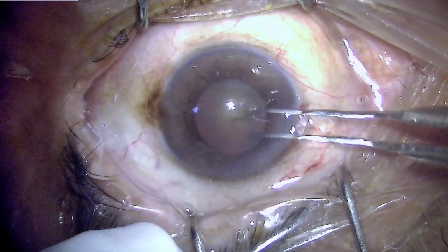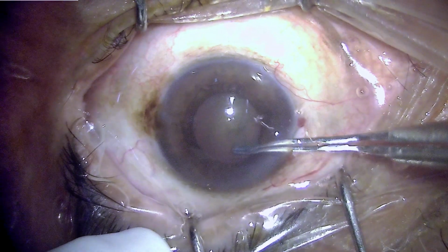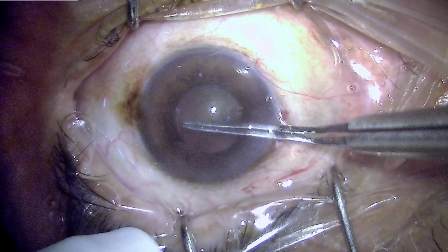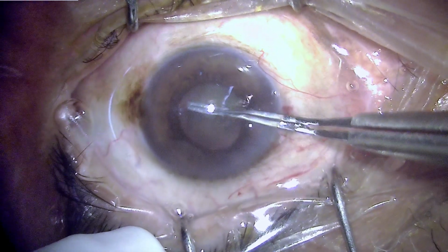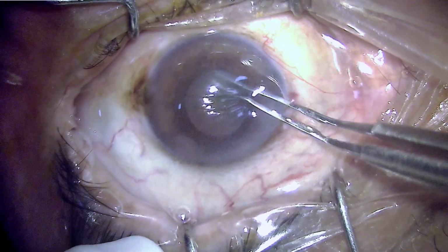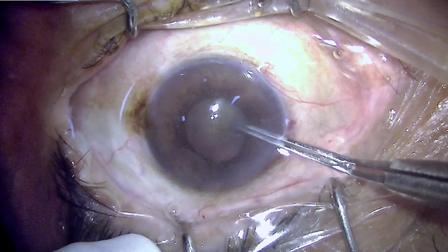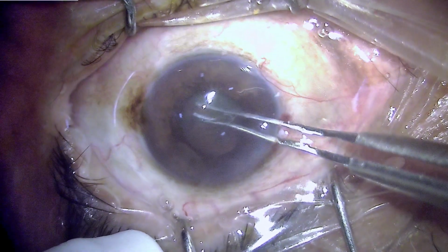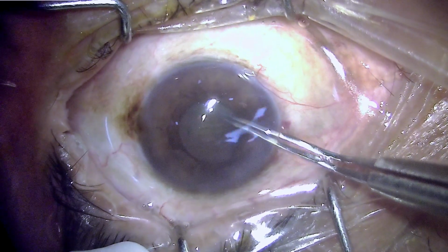So we are proceeding for capsular access, and this should not be a challenge in these cases because these cases have a capsule which is not very elastic, and it is not very common to have the capsule run up to the periphery, and it is easier to tear it away. So we are having an uneventful capsular access.